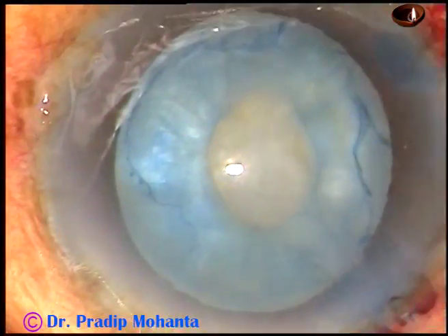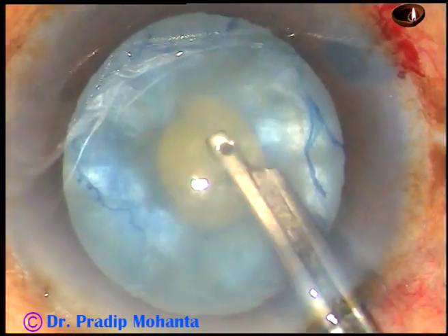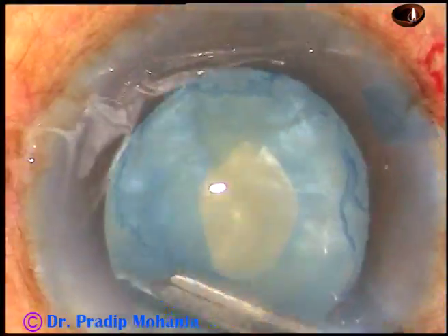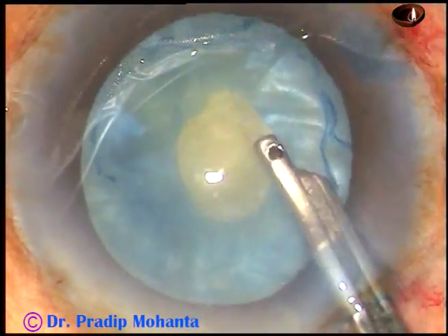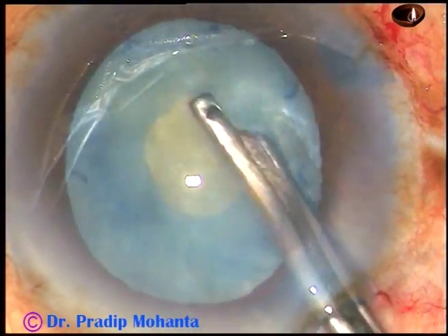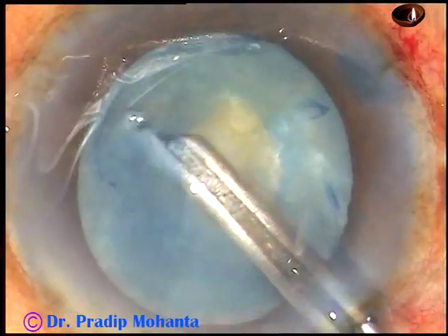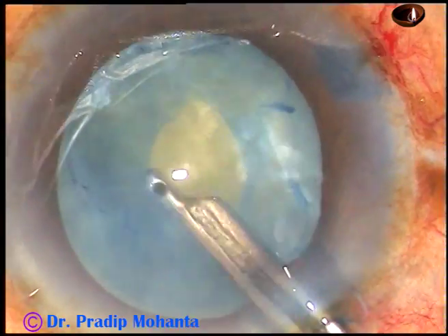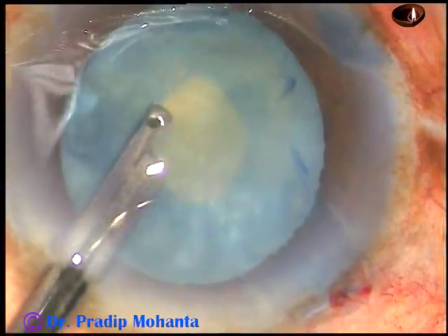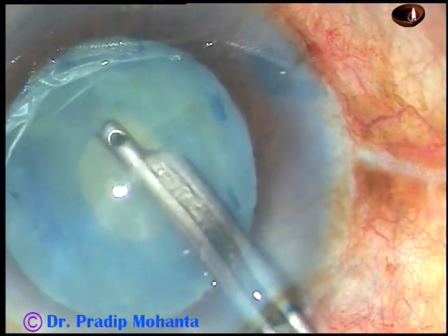Now I am going to use a 23-gauge Simcoe cannula to aspirate some lens matter, some cortical matter. This will help in two ways: the anterior chamber will gain some depth — it was very shallow — and the intra-lenticular pressure will decrease. So two advantages: decreased intra-lenticular pressure and a deeper anterior chamber of normal depth.